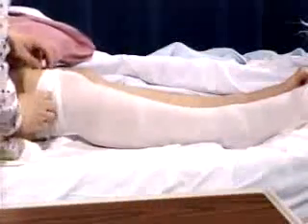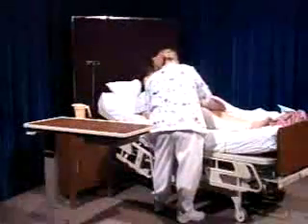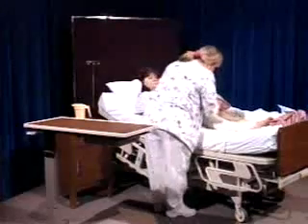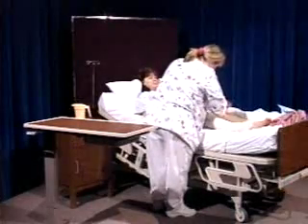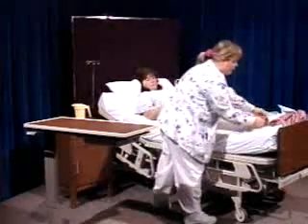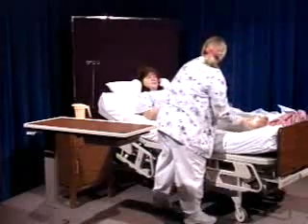Draw the stocking smoothly towards the thigh. Check to be sure that the stocking is applied evenly and smoothly. There should be no wrinkles. Check the material on the toes to be sure that it is not too tight.